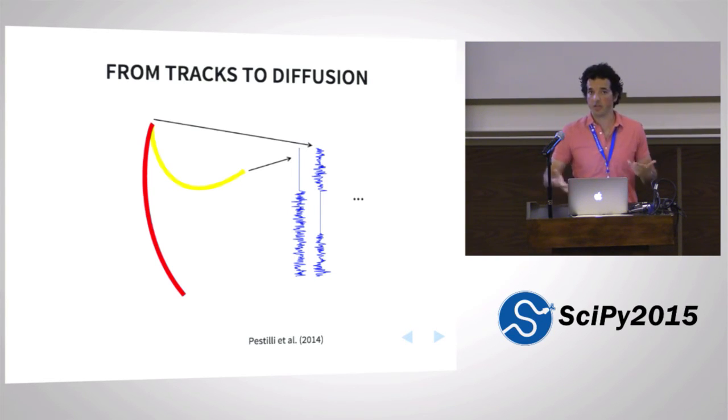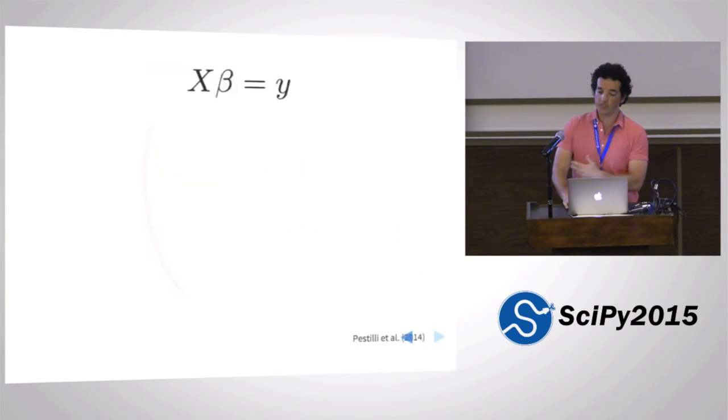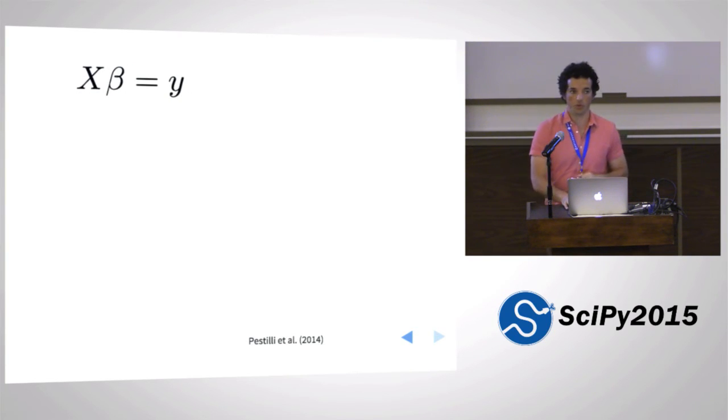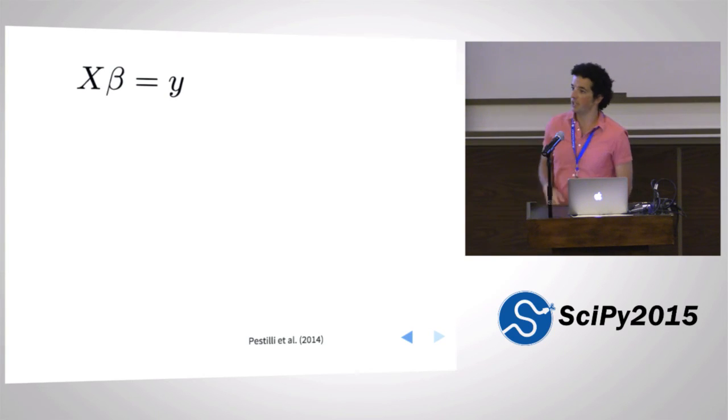And we sometimes estimate on the order of 500,000 tracks in an individual brain. So this matrix goes on for quite a bit, both in that direction and in that direction. We then compare that to the actual measured signal. Now, this scheme forms a linear model. So the matrix of the signals predicted for each one of the fibers across all the fibers is on the left side here as the big design matrix X.